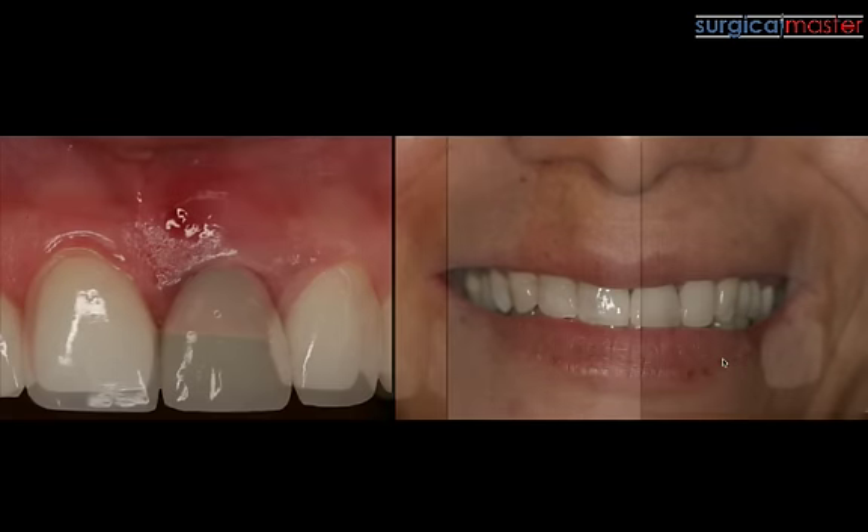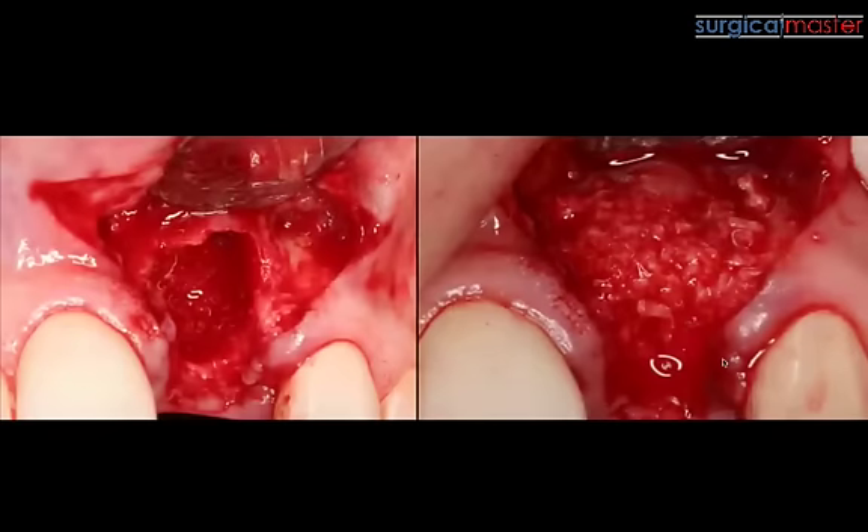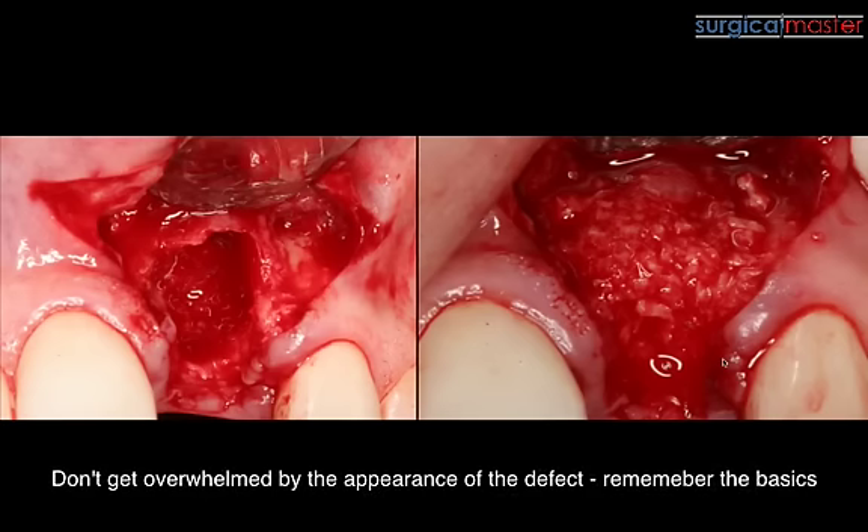If you look at the radiograph, everybody can see the reason for the infection. This tooth had obviously a big crack and a big perforation. As you reflect the tissue, you can see the extent of the loss of the buccal plate — quite a bit of bone loss. You can see that we have the interproximal bone and tissue, but the buccal plate is very compromised.